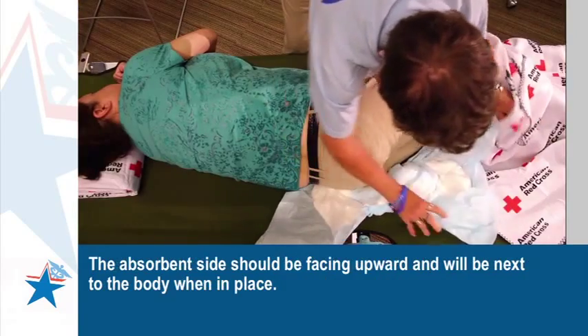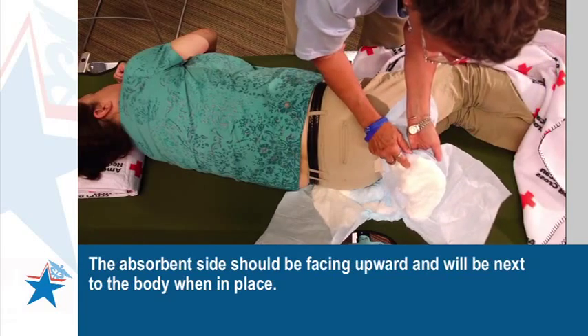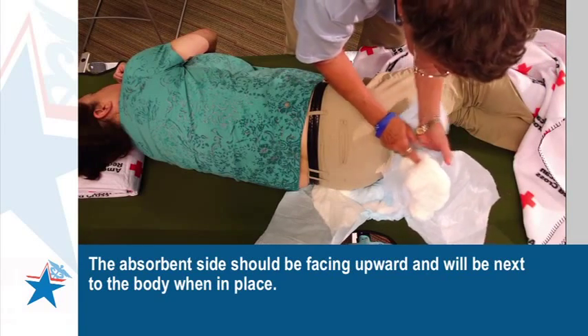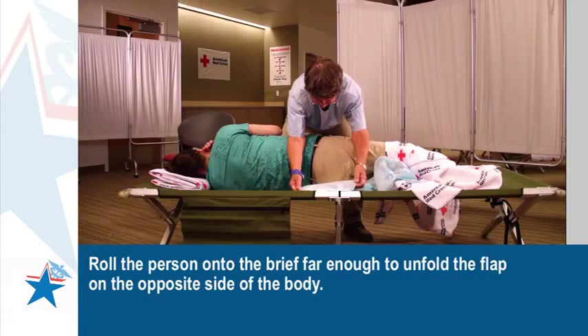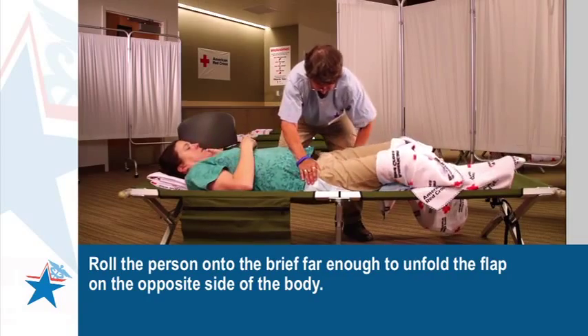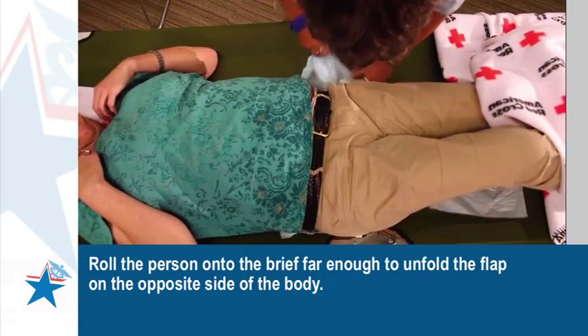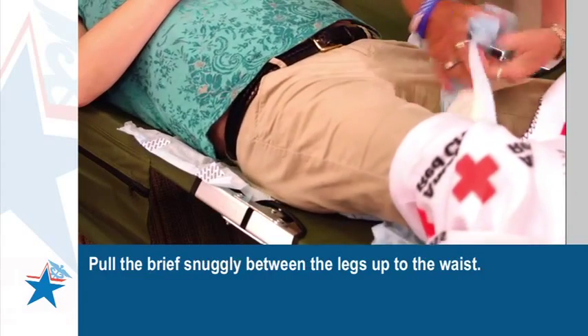The absorbent side should be facing upward and will be next to the body when in place. Unfold one flap of the diaper. Roll the person onto the brief far enough to unfold the flap on the opposite side of the body. Pull the brief snugly between the legs up to the waist.